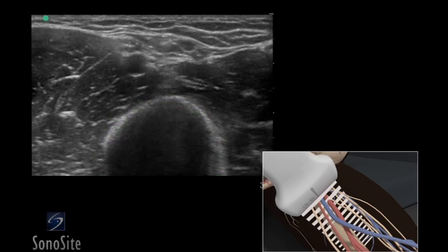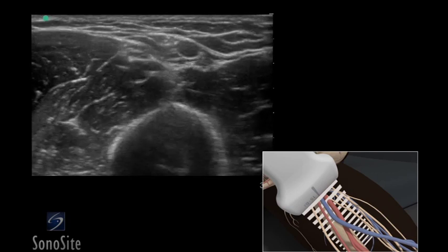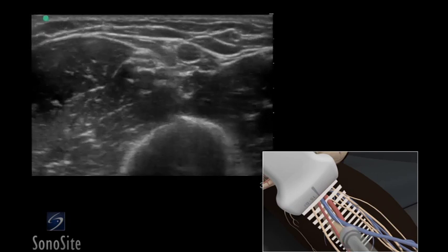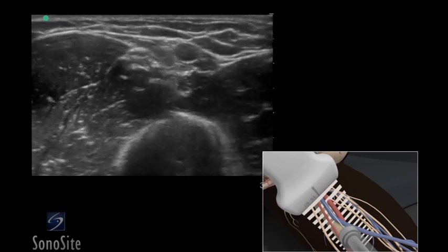Adjust the transducer so it is centered over the basilic vein. Follow the needle entry by slowly sliding the transducer in the direction of needle advancement. The needle will appear as a small bright dot.